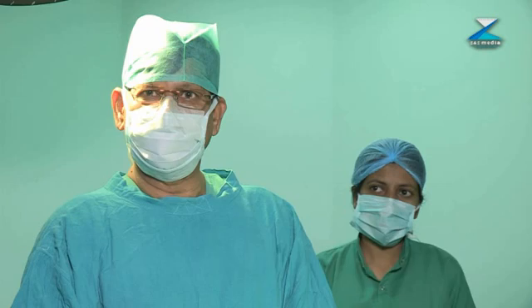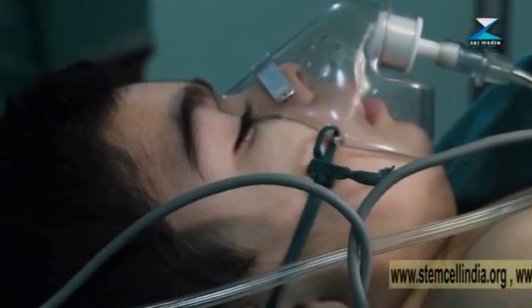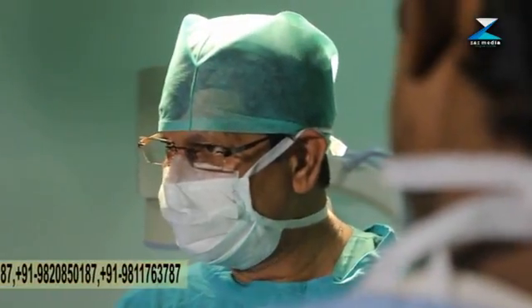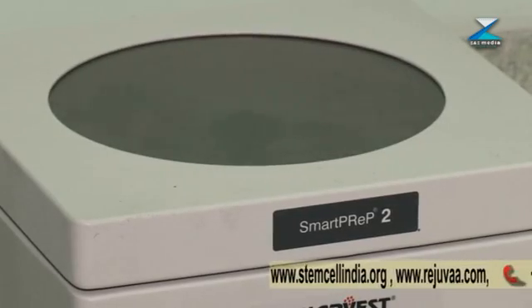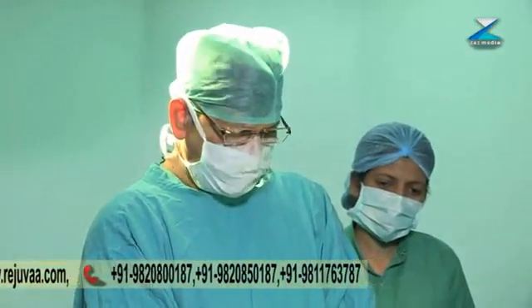This is a two-year-old child who is a case of spastic quadriplegia with CP with global developmental delay. We have planned for autologous bone marrow cell transplantation and it has got three parts. Step one is retrieval of the bone marrow from the posterior ILAC crest. Then we will process it through the BMAC technique and inject it into the CSF via intrathecal transplantation. So step one, we are going to start with the bone marrow retrieval.